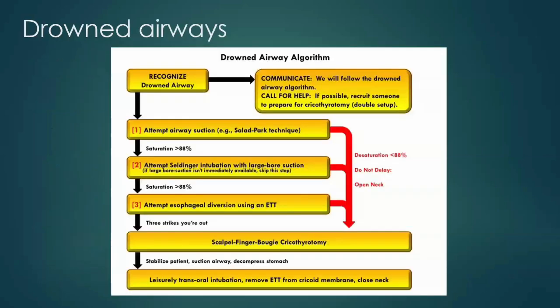So now I'm going to be moving on to the drowned airway. A drowned airway speaks to an airway where, when you go in to intubate, all you can see is fluid. There could be blood, it could be excessive secretions, it could be gastric aspirates, it could be a whole host of different things. But the physical thing is that you cannot see anything beyond that fluid itself.